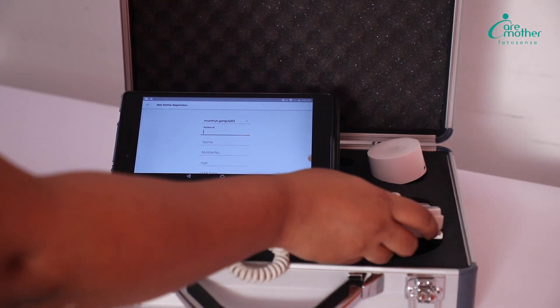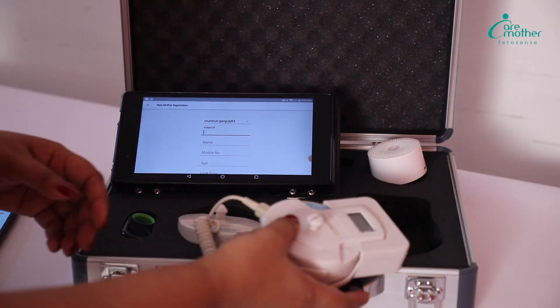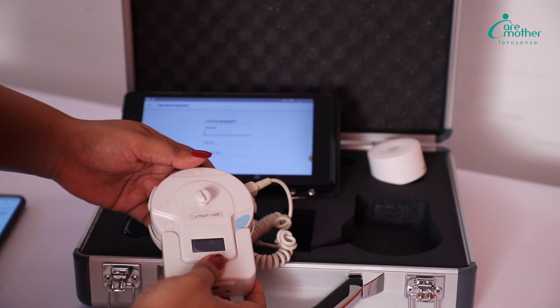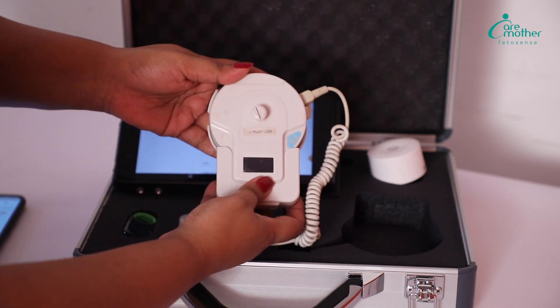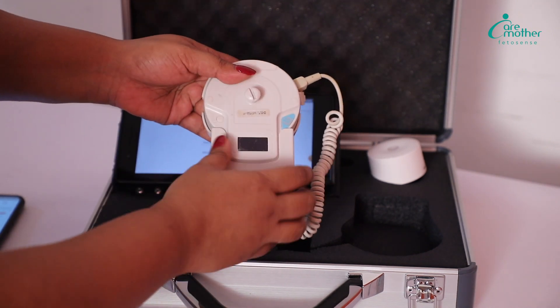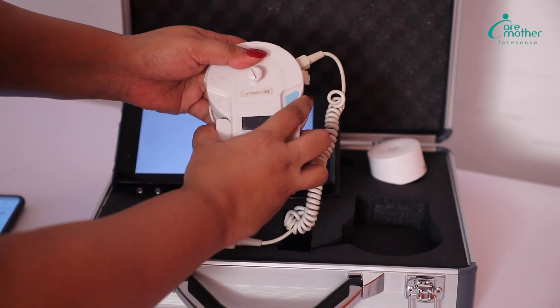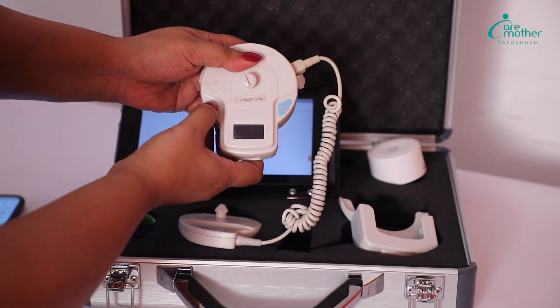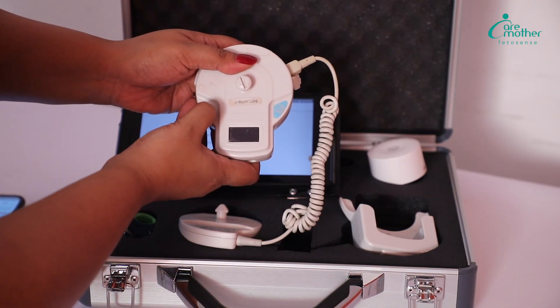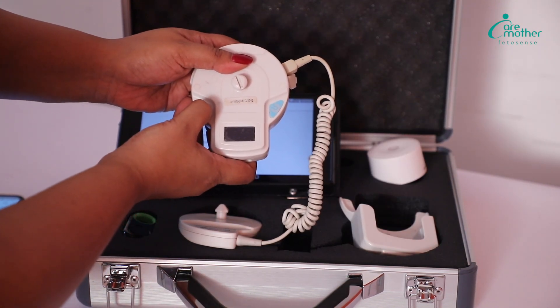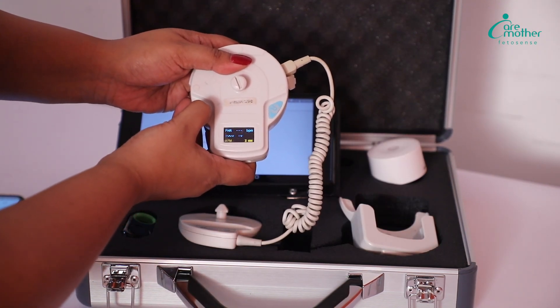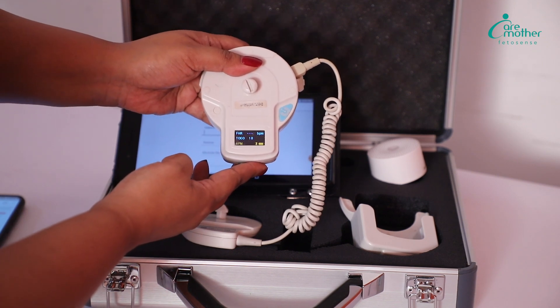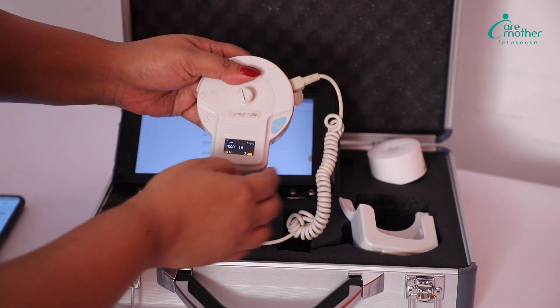After we have come to the registration page, we will need to switch on the devices that are needed for the test. The first device we will switch on is the FHR probe. We take off the charging pod, then click on the switch-on button. The screen comes alive and the FHR probe is ready to use.